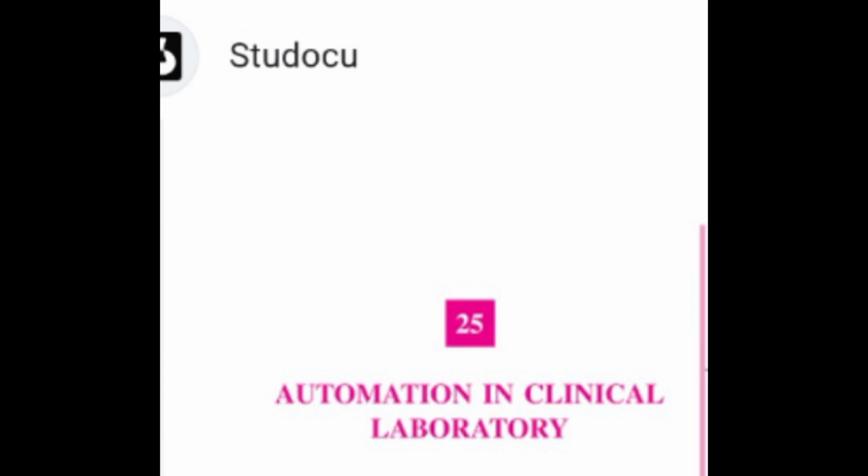Batch analysis: many samples are processed for analysis in the same analytical run. Sequential analysis: each test in the batch enters the analytical process one after another and the results are printed in the same order as they are fed. Continuous flow analysis: each sample in the batch flows one after another in sequence and is subjected to the same analytical reactions as other samples at the same time.